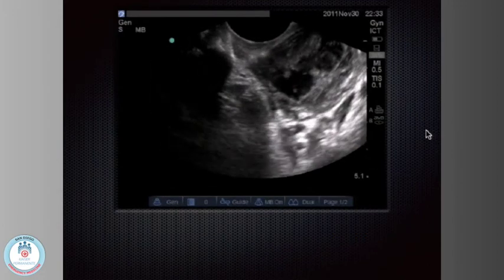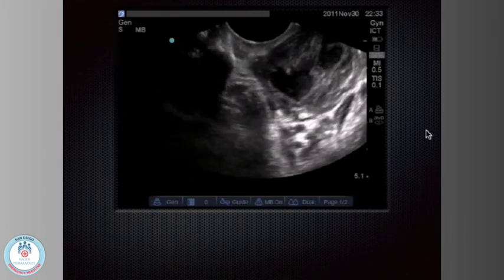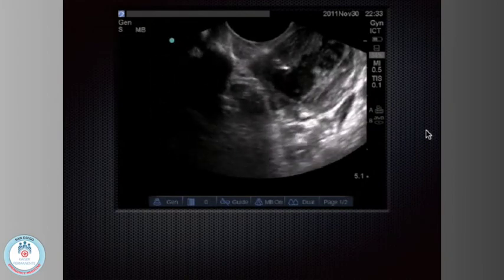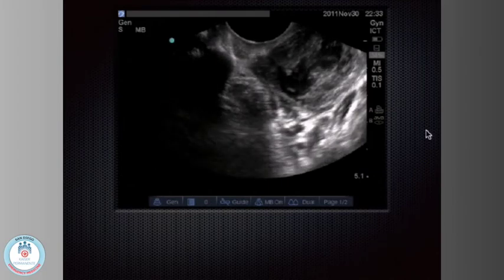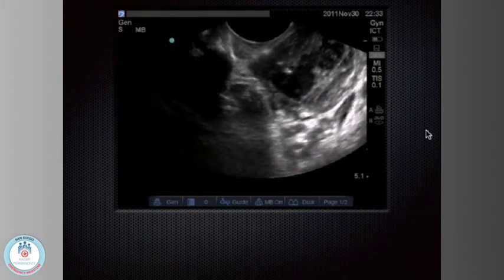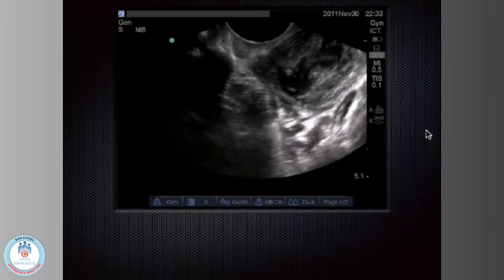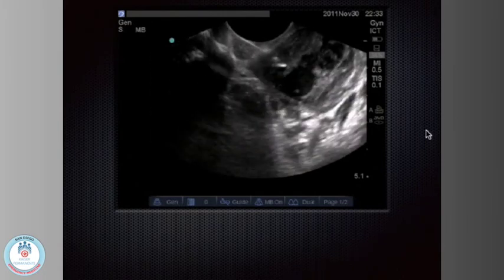All right, we're doing a procedure. Anybody know what we're doing? Yes, PTA. So we have the endocavitary probe. I don't call it a transvaginal probe around the 12-year-old male that I'm doing this on. Endocavitary probe. I have a sheath on it, not a condom. I put it in the back of the throat, numb the throat up, and I can see the needle going into the abscess and draining it under ultrasound guidance.